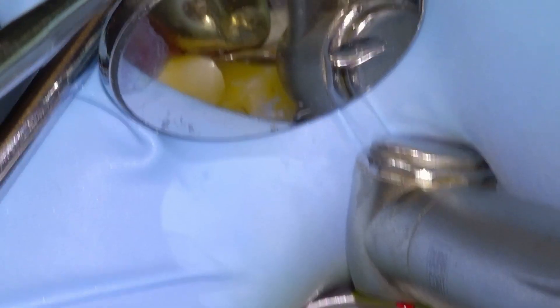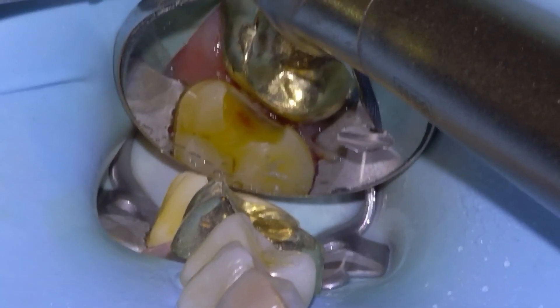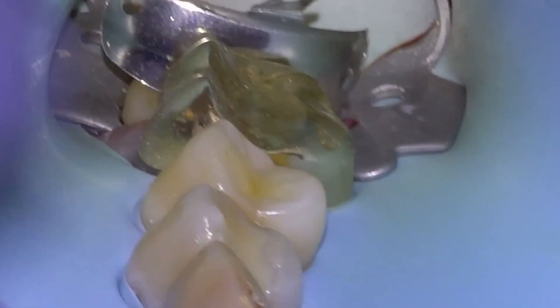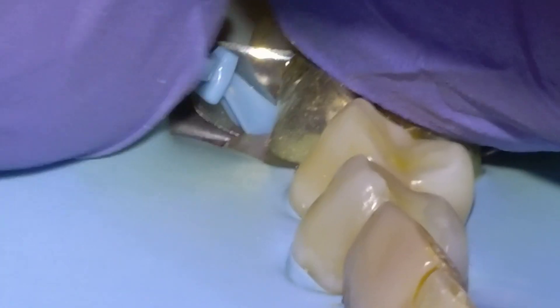That's pretty much looking good to go, so I think we're going to get to restoring here next. Sometimes if I scratch gold or just the crown, I'll take a carbide flame and just try to smooth it off a little bit. But that's ready to restore, so I'm going to get a sectional band on and then stabilize it with our plastic wedge. Apply the separator ring, and I'll usually leave it for a little bit so that the PDL can stretch out.